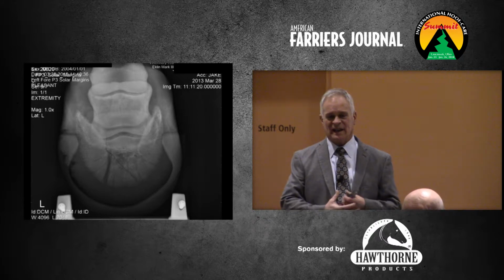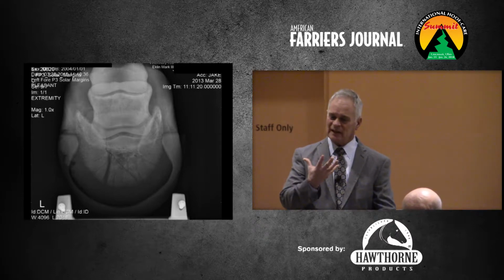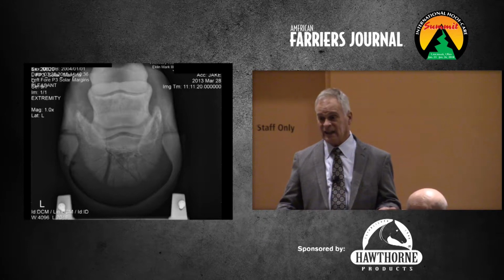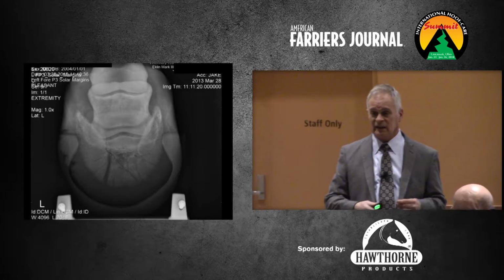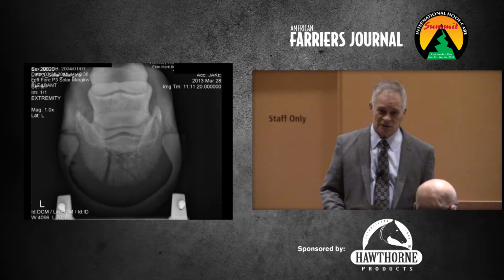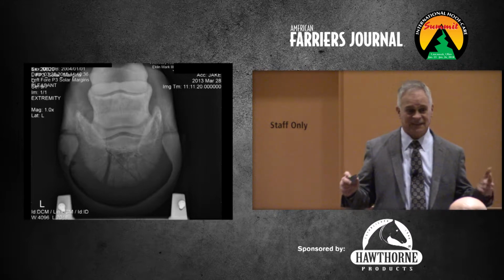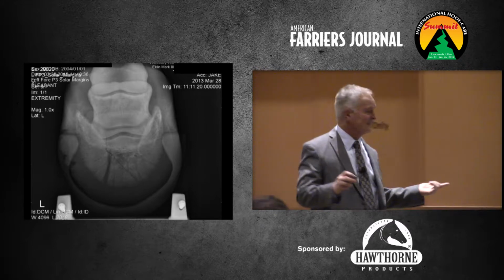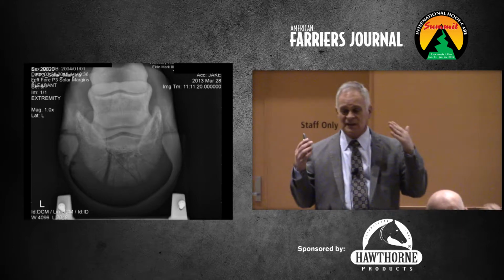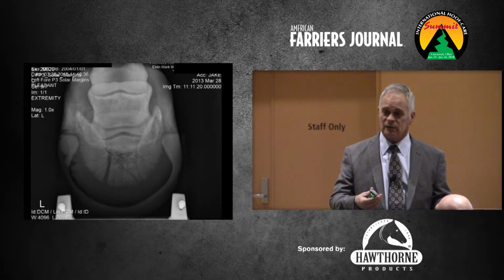P3 must have had enough bleeding inside the hoof capsule that's why it popped out at the top and drained, but stayed lame, obviously, and the farrier couldn't find an abscess. So again, if you get stuck in that situation, just bail and tell them to call the vet. And so again, with that, we used all that information to work on a therapeutic plan to get that to heal with our farrier.